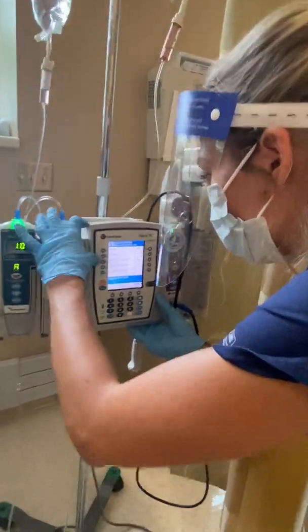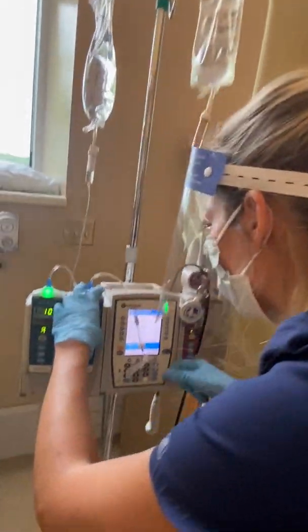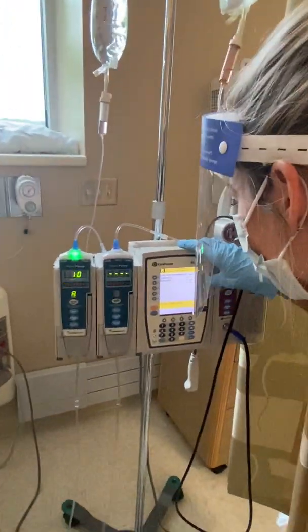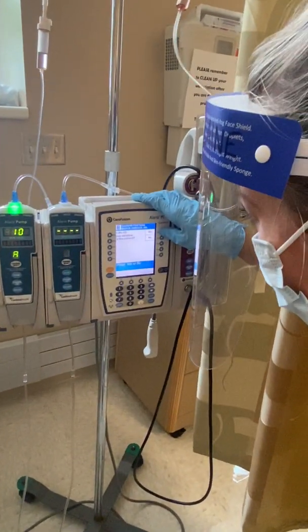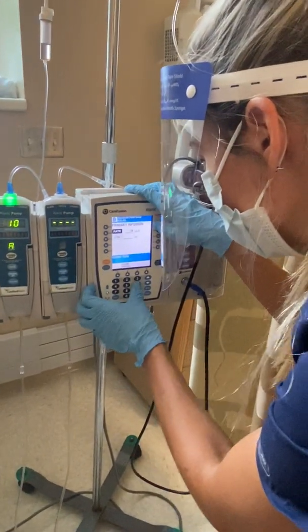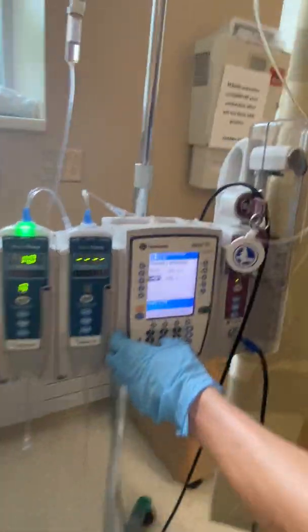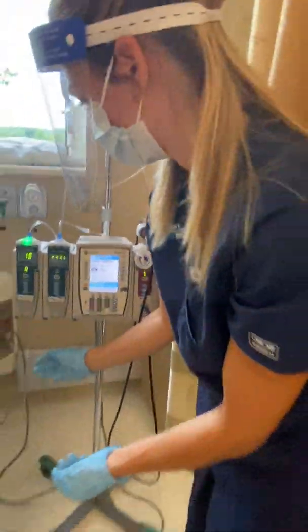So I'm gonna pick guardrails, IV fluids. We've got her bag of 0.9 normal saline. Yep, and it's already infusing on channel A, but just at TKO. So we're gonna say yes, 0.9 saline. All right, so we're gonna run this at 167 mils per hour. And because it's a bolus, we're gonna do 500, the whole entire 500 mils bag. Okay, all right, and then that's all set up.